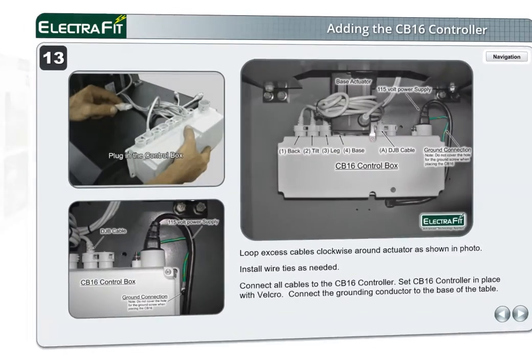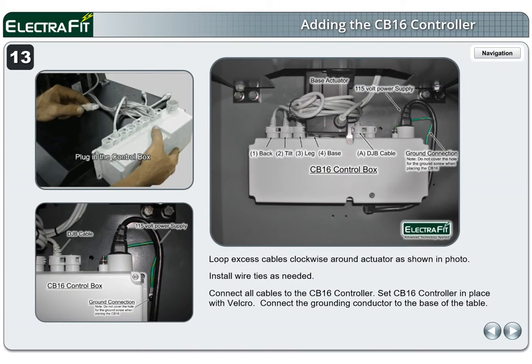Page 13. Loop excess cables clockwise around the actuator as shown in the photo. Install wire ties as needed. Connect all cables to the CB16 controller. Set the CB16 controller in place with Velcro. Connect the grounding conductor to the base of the table. Note: all plugs must be fully seated for the table to function.